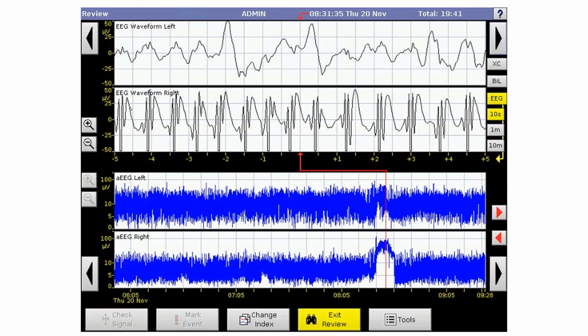Okay, so let's talk about what are these features of seizures on aEEG. What we're looking for is the archway, a kind of rounded arch in there. Sorry, I'm just trying to clean the line really quick. So we want an archway. This is a beginning, a middle, and an end, a crescendo, decrescendo of our aEEG band.